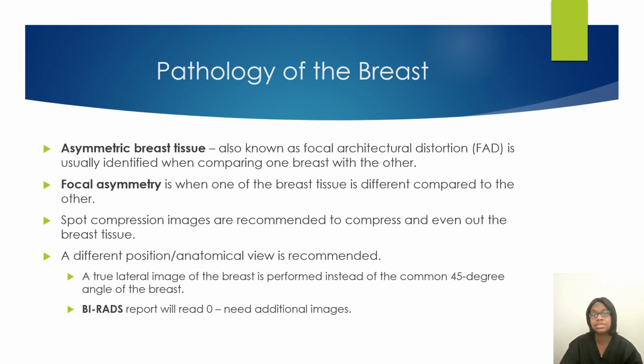The patient will have to be in different views. Depending on where you work, the radiologist may tell you that they would like you to start with a true lateral image, and then you can do your CC view, or you can spot your lateral and then spot your CC view.